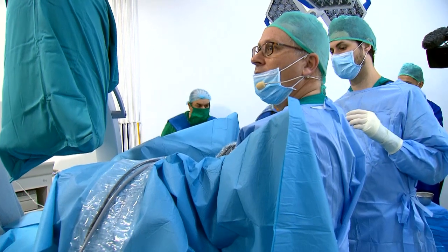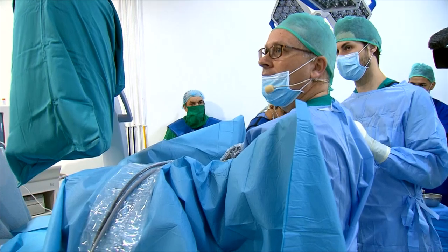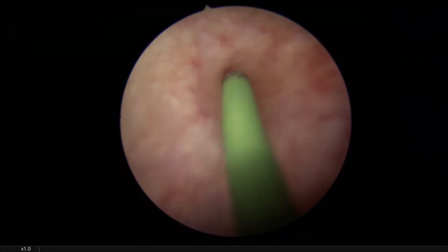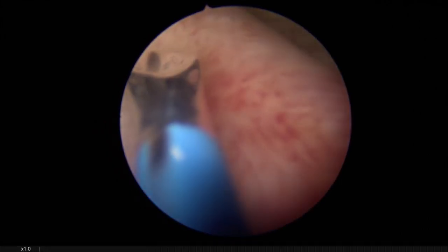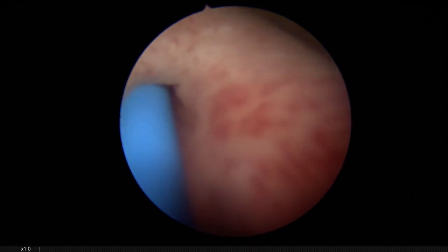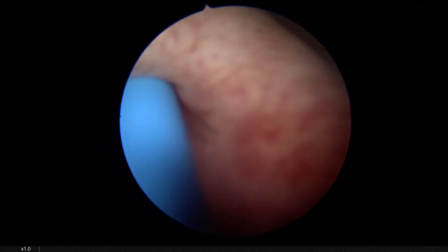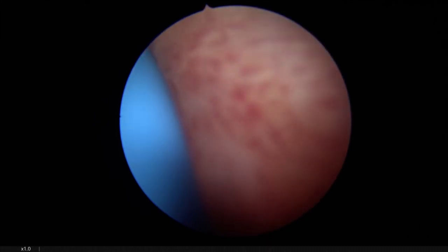Okay, now we are forwarding our catheter. This is what I showed to you. This is the guide wire which facilitates the insertion of the balloon catheter. And now you can clearly see how the balloon is passing the ureteral orifice. It is 100% comfortable. It's not hydrophilic, and it's not needed, but it is very smooth. There are no steps, no edges, nothing like that. Now, please show X-ray.